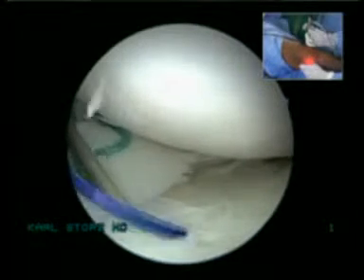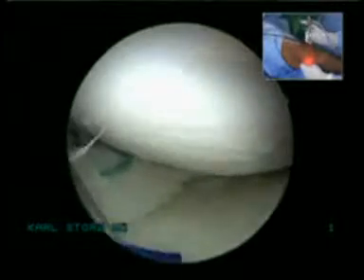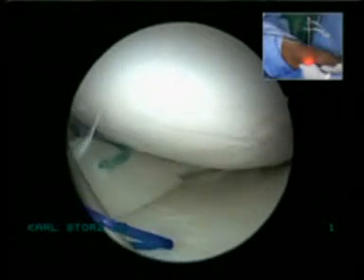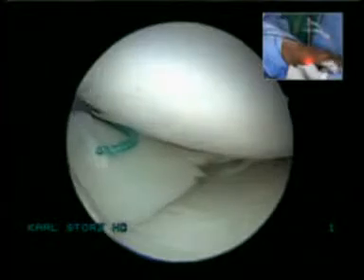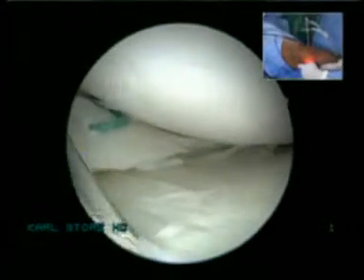And in India, resurgery is perceived as a surgeon failure. Can you pull the suture back? Especially when you do the ACL with a bucket handle tear, and it comes with the failure of the bucket handle, then surgery failed. It's funny, it's a sort of reverse philosophy. Now give me the tendon graft.